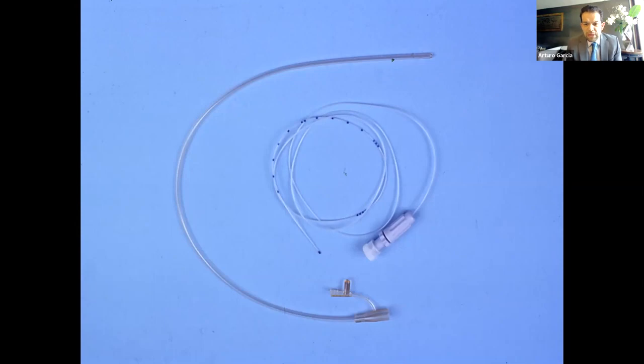And they have a peridural catheter, which is fed into, as you can see here, the holes of the UPP catheter. You put the tip inside of the holes, and then you feed both catheters inside. Once you get urine and you know you are inside of the bladder, then you dislodge the peridural catheter, and after you do this, you feed the rest of the peridural catheter inside. This is very useful because when the patient gets to the maximum cystometric capacity, you can remove the UPP catheter, and then the patient is left only with a very, very thin tube inside of the urethra, and the pressure flow study you're going to get is much more similar to a normal void the patient has.